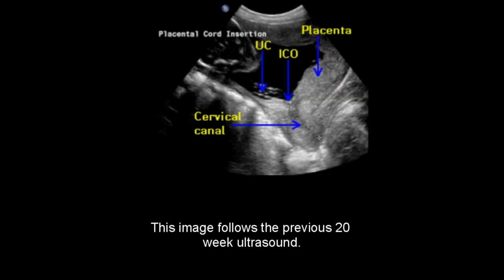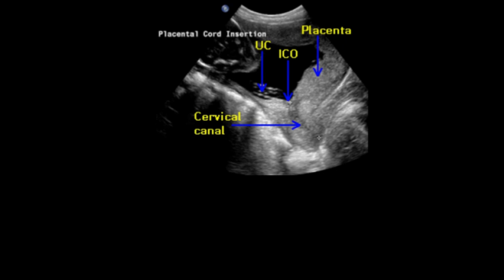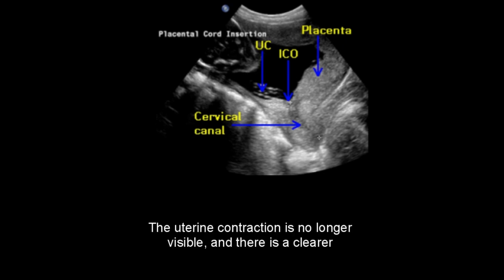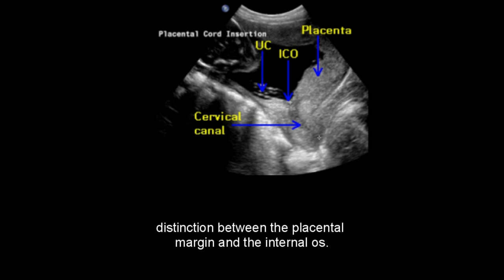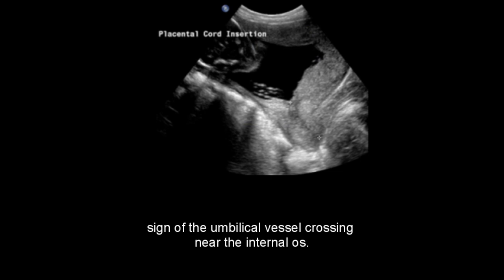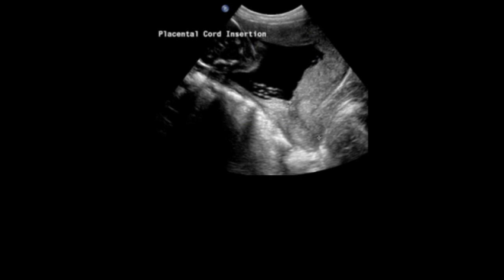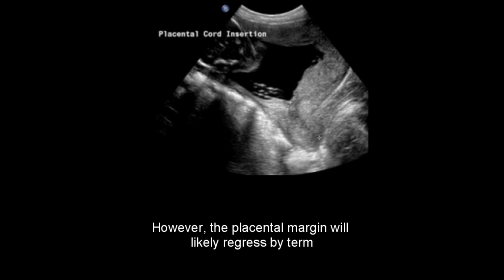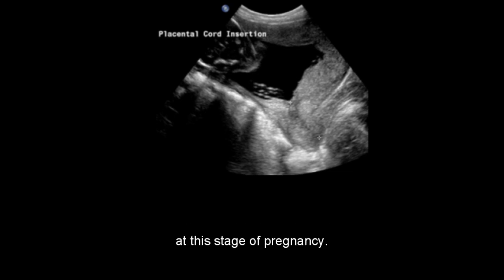This image follows the previous 20-week ultrasound. The uterine contraction is no longer visible, and there is a clearer distinction between the placental margin and the internal os. The umbilical cord is located in the lower uterine segment, but there is no sign of the umbilical vessel crossing near the internal os. A transvaginal ultrasound is recommended; however, the placental margin will likely regress by term at this stage of pregnancy.